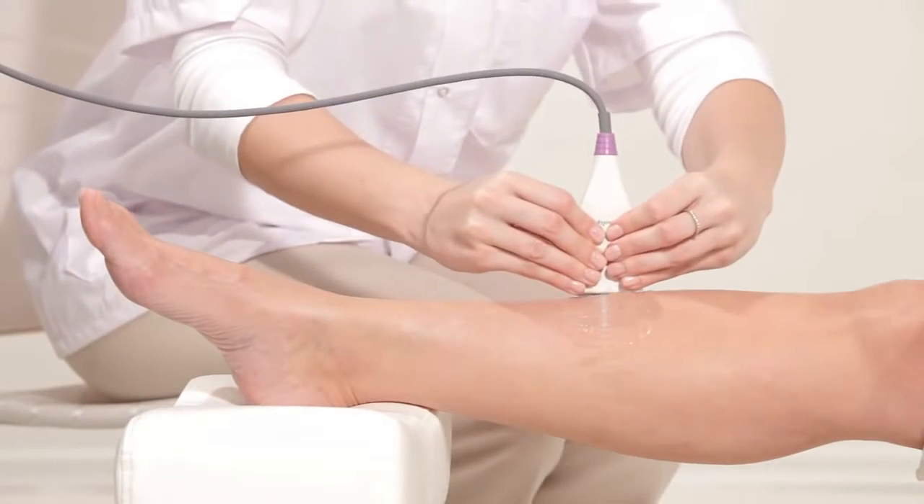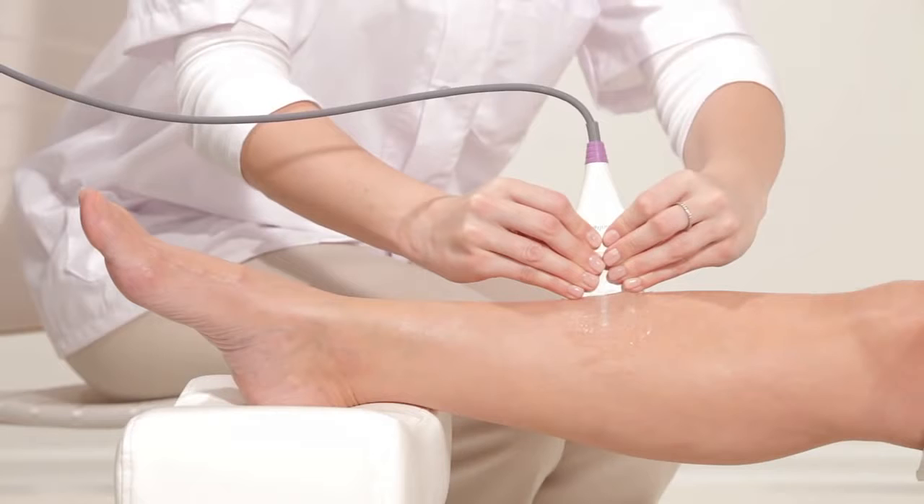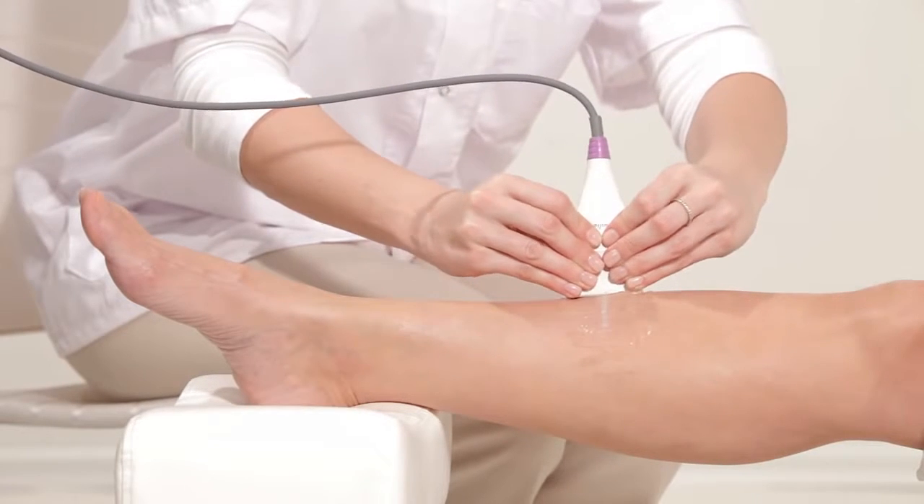Press start to begin scanning. Place the probe on the measurement area. Align the marking on the middle of the probe with the line on the leg. Hold the lower side of the probe with both hands.